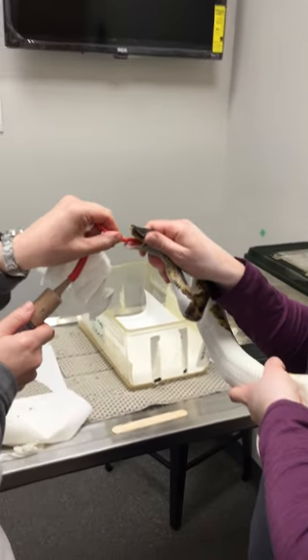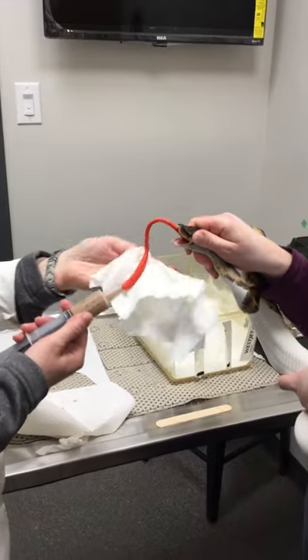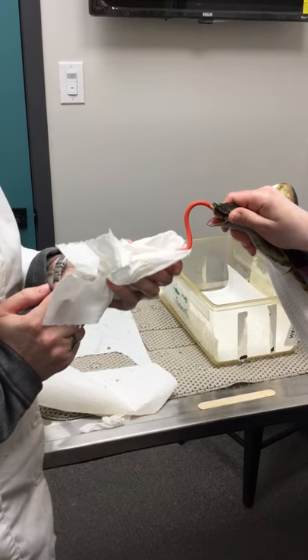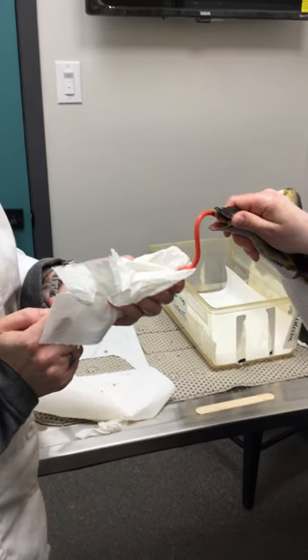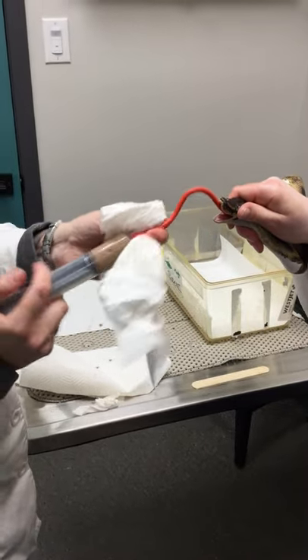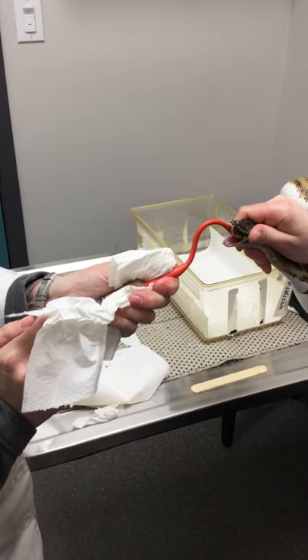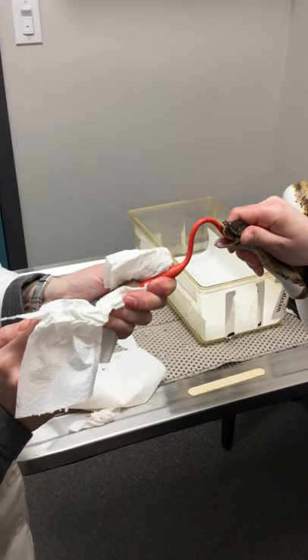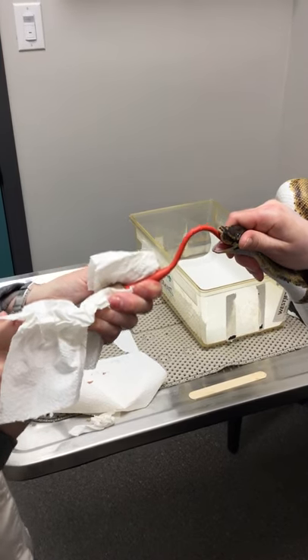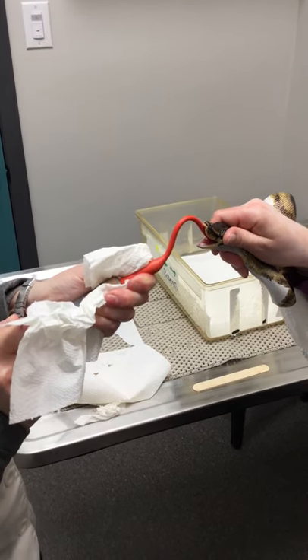You're going to go in most of the length of the tube. The tricky part is when you have to push the syringe, because the material is really thick, so you want to hold your tube onto your syringe. It's going to take a fair bit of force to get the food to go through. Make sure you hold your orange tube tightly onto the syringe, because when you start forcing it, the tube wants to pop off — and you don't want to blast your trusty assistant with a bunch of tube feeding mix.